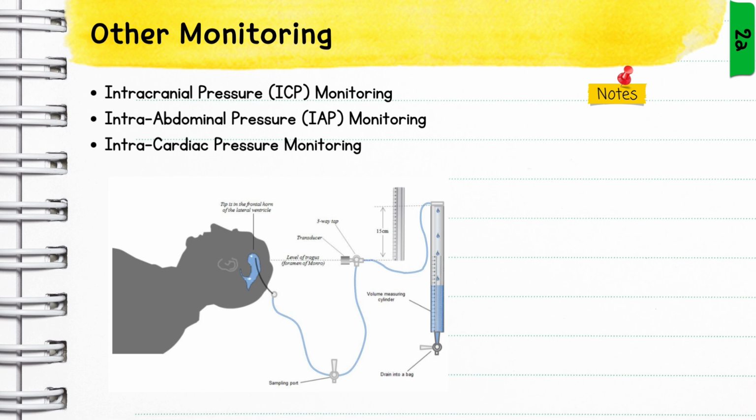The ICP, or intracranial pressure, is probably the one you're most familiar with at this point, if you're familiar with any of these three. That's the one used to measure the pressure inside of your skull. Remember, your skull is an enclosed space. If something gets bigger, something's got to give. And the only thing that's really got to give is the tissue coming out, and that's bad, and we'll call that herniation. We'll talk all about it when we go into our neuro lecture.